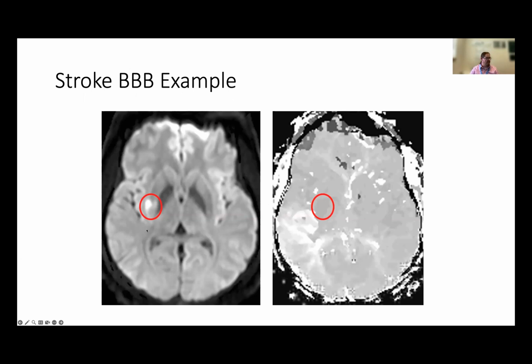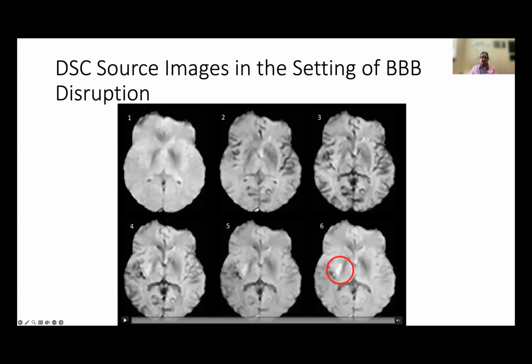You can see on the diffusion scan that there is an area of injury that occurred. And there is also a perfusion abnormality more distally, which is probably where the clot has traveled further along the vessel. So there is some hypoperfusion there, but we're going to focus on this area that's been reperfused. And you can see here, because it's a little bit dark, that means it's hyperemic. So that's increased blood flow to this recently reperfused ischemic injury.